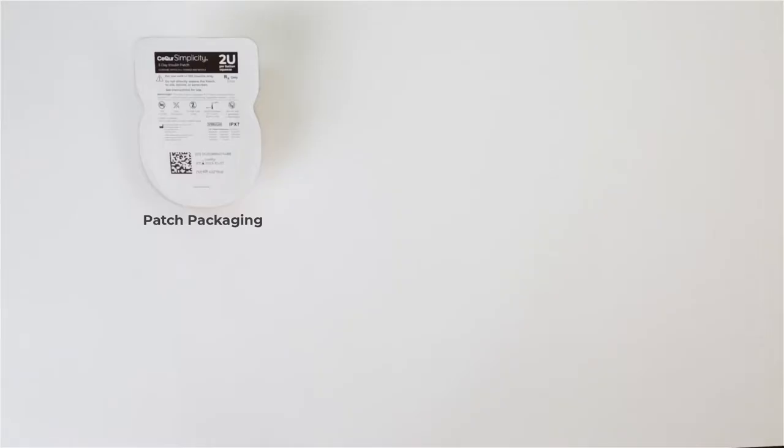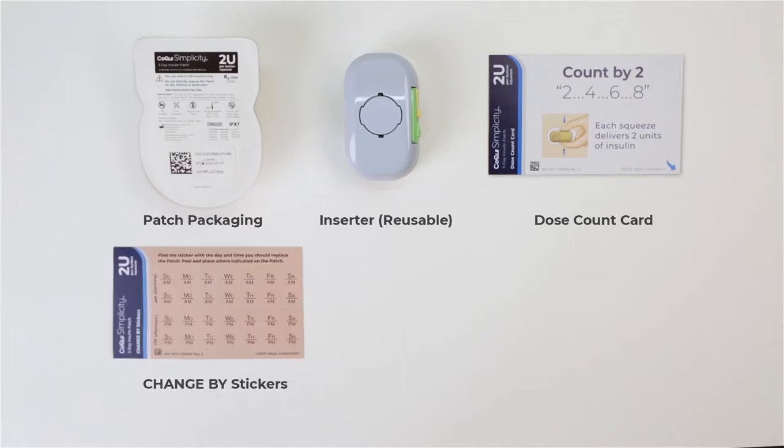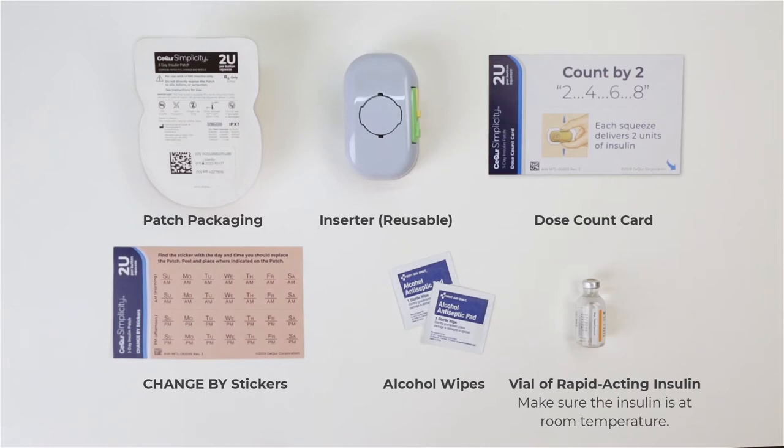Let's get started. Gather the supplies needed to prepare the patch: a package with the patch, fill syringe, and needle; the inserter, which is reusable; dose count card; change-by stickers; alcohol wipes; and a vial of Humalog or Novolog Rapid Acting Insulin.